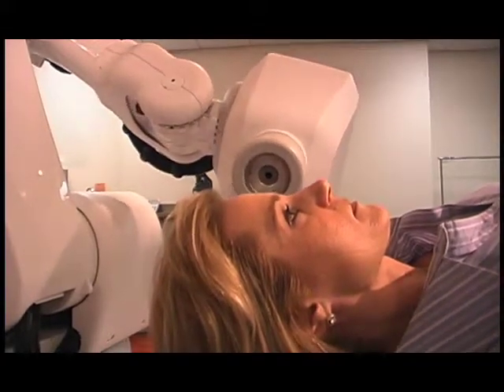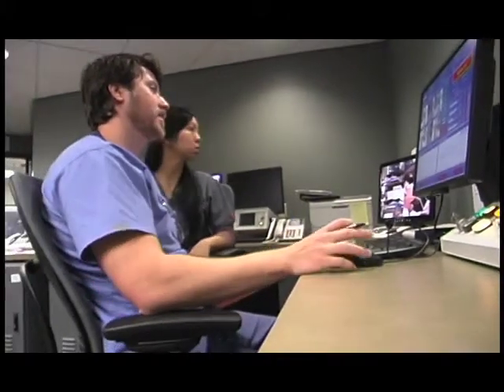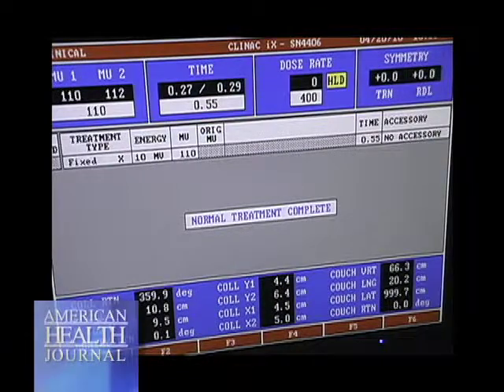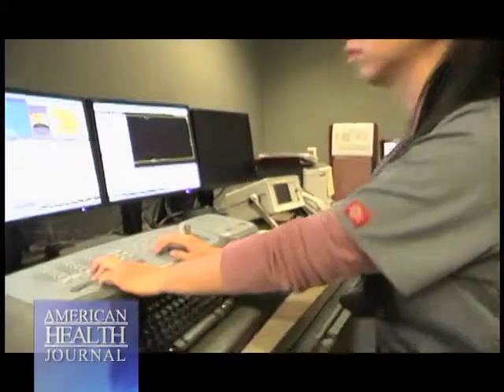The way that precision is obtained is not only with excellent planning through the planning system that comes with the CyberKnife, and also using the precise number of beams that we need to use to deliver the radiation, but also there is imaging in the form of X-ray imaging that goes on every few seconds while the treatment is actually being delivered. And there is a double check between the image that's taken at the time of the treatment and the image that was taken at the time of treatment planning, and those two are compared with the computer and with the naked eye to ensure that there's been no movement of any of the structures.